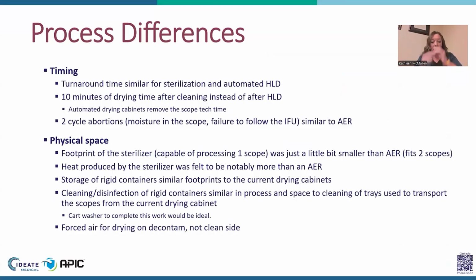So what was different? Timing and physical space were 2 of the biggest things that we wanted to know and learn a little bit more about. So when you compare the turnaround time for a sterilized scope versus one that was automated HLD per our current process, it was very similar. I will say we had the benefit of some recent upgrades to our endoscopy center.